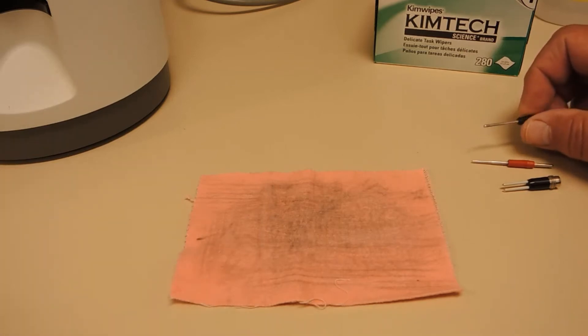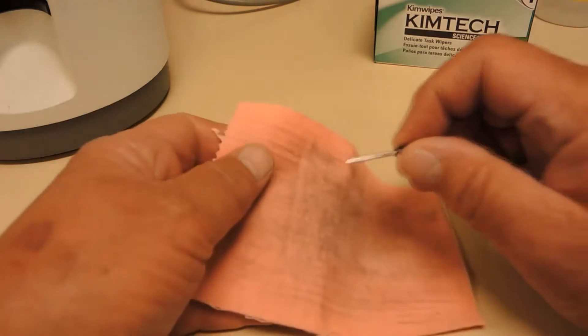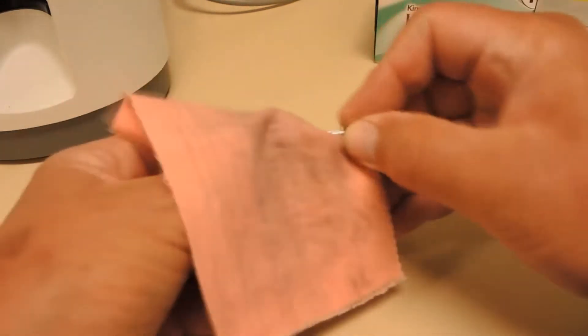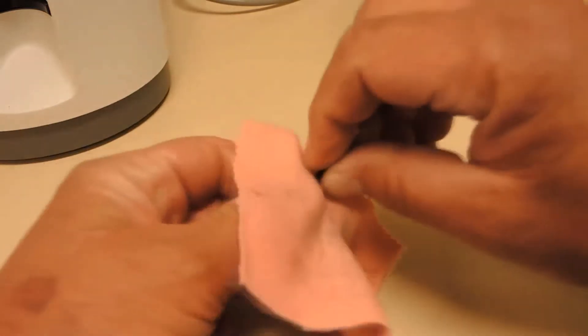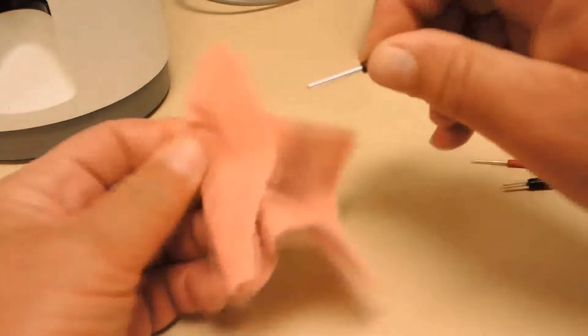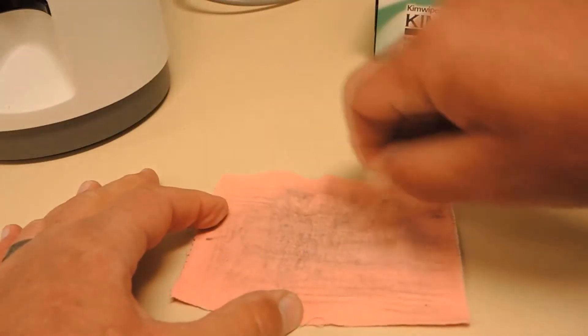First thing you want to do is clean the electrodes on the silver cleaning cloth. With the red and black electrodes I just wrap the cloth around them and pull them through the cloth, and you can clean the ends off as well by dragging it along the cloth.